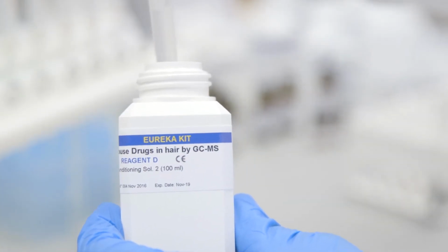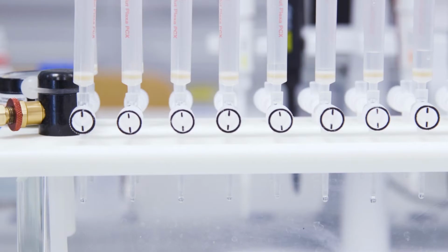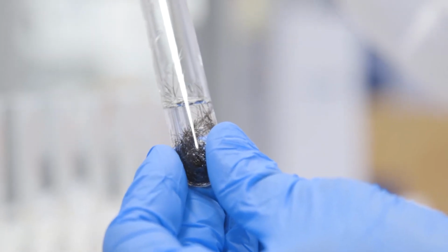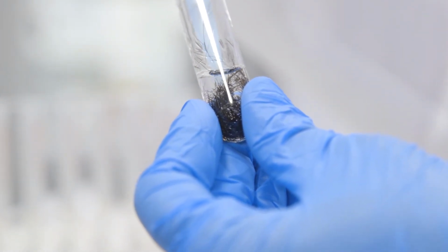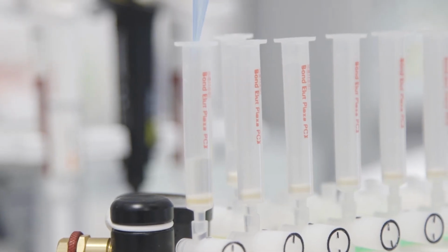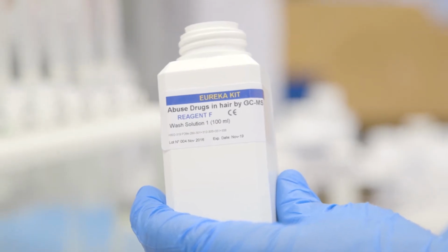As in the preceding step, we should add 2 ml of reagent D, conditioning solution 2, to each column. Pass the reagent through the column and discard the eluate. We add all the supernatant of calibrators, controls and unknown samples prepared in the previous phases to the conditioned columns and discharge it with a flow of 1 ml per minute, drop by drop, if necessary with the help of a vacuum. After we have activated the columns and loaded the samples, we wash the SPE columns.